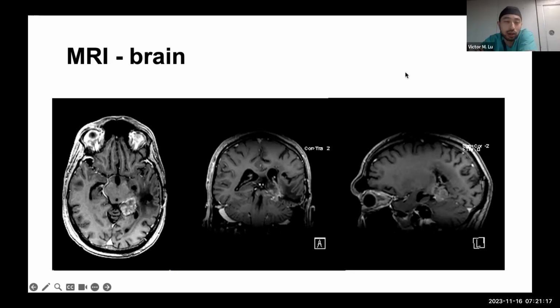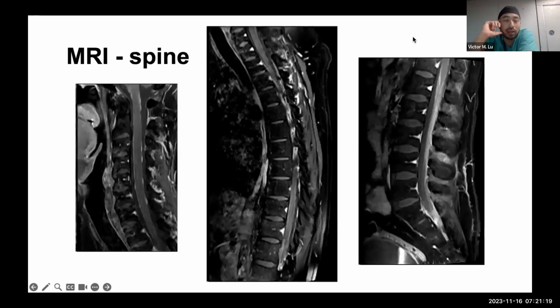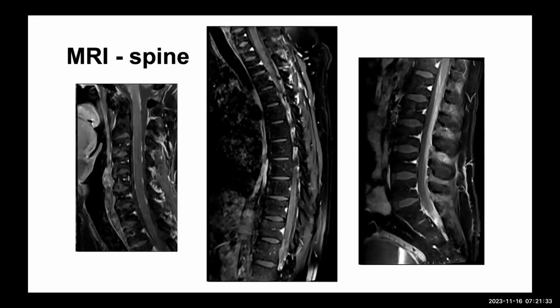Okay, so on that note, you go ahead and you obtain MRI sequences of his spine. And you see them all here. Let me know, can you see anything on these sequences? Do you want to tell me what these sequences are? Sure. Looks like, again, we have T1 with contrast. Looks like it's full neuraxial imaging.